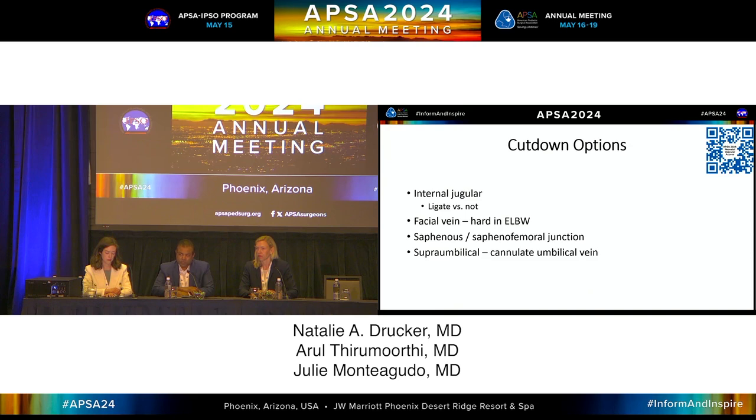That's very quick. I think everybody who does this in their hands, it's just not first on our minds. So remember, this is a small child. We could probably do it within 2 weeks of birth, maybe up to a month. But in a micropreemie, this is a good option. It's going to be the biggest vein you can find, easily accessible, well tolerated, very safe, done at local at the bedside, right? So we're just trying to get in and get access.